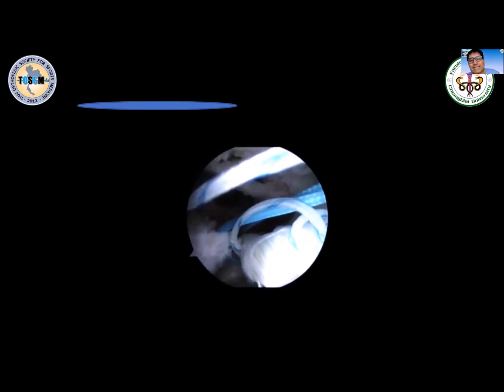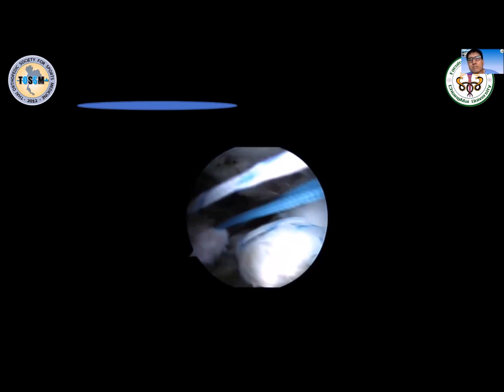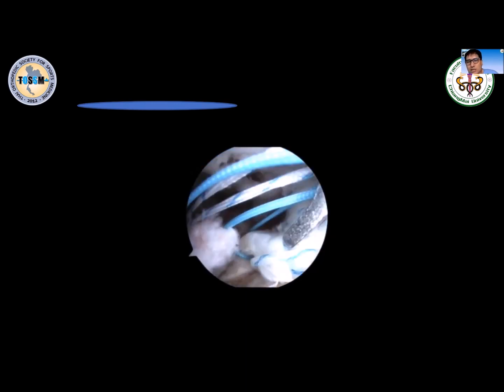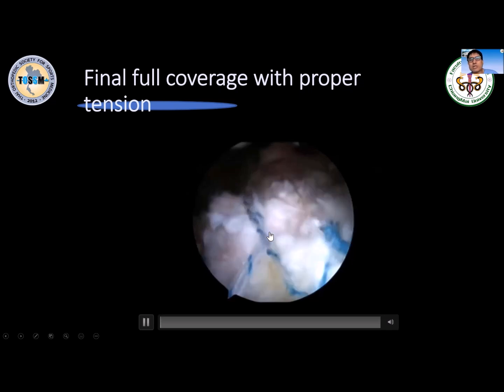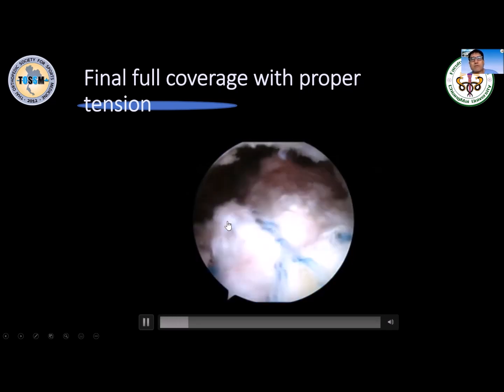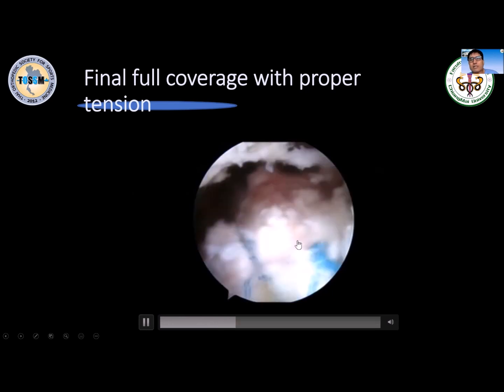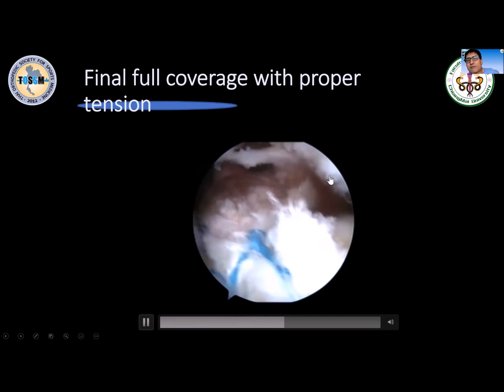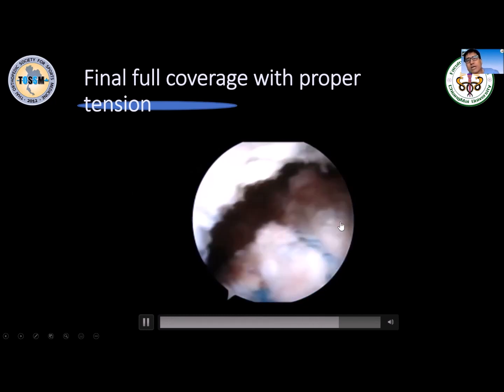So in my series, I didn't do the double row just like Yang Su did. I did the double row for everything, combining all the infraspinatus and biceps together just like this picture. So this is the picture after repair. The infraspinatus comes down. Right here, this is the bicep. You can still have some hole, a defect of the cuff, a little bit right there. It's not too bad though. It covers the head pretty well.